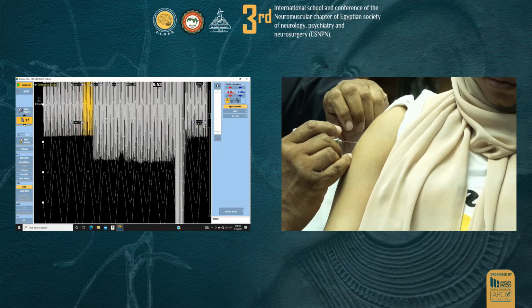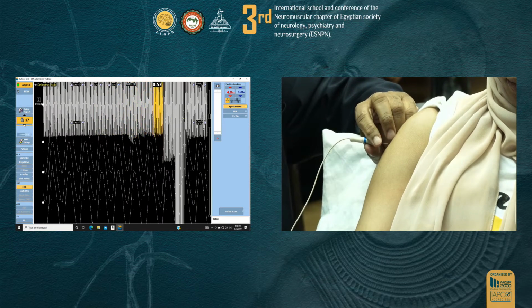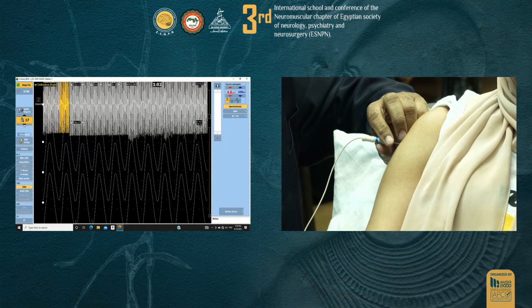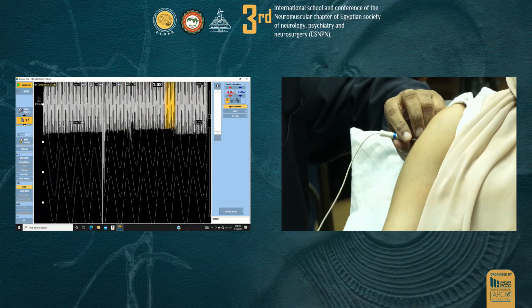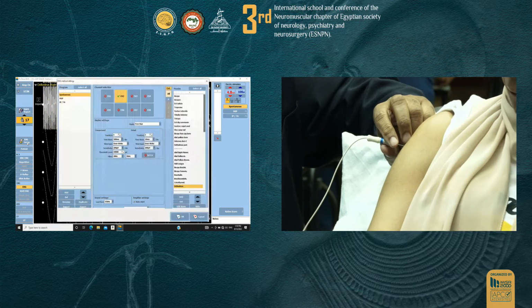And there's a lot of artifact for some reason. I want to know why. Just making sure. Yeah, because the baseline already was too. Just give me a second. Okay, I'm in the muscle now. Is there too much artifact? Put on the 60 hertz notch filter, please. There's a lot of 60 hertz cycle going on. Notch filter right up there.